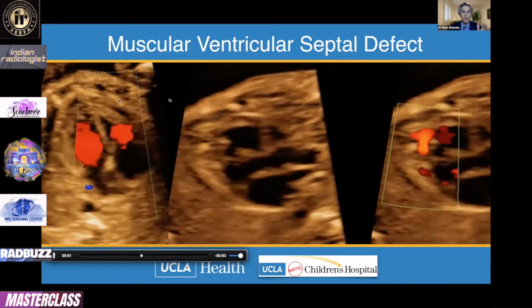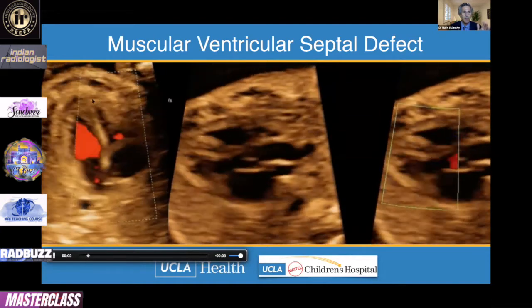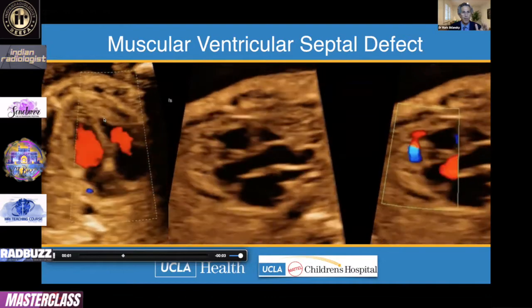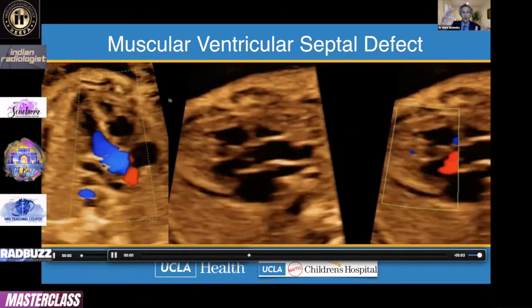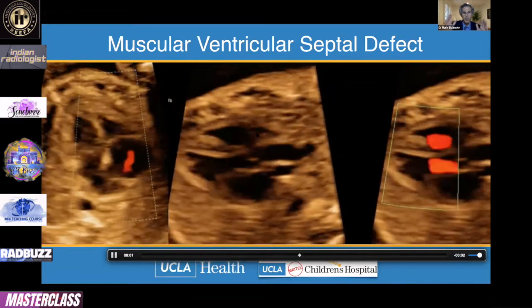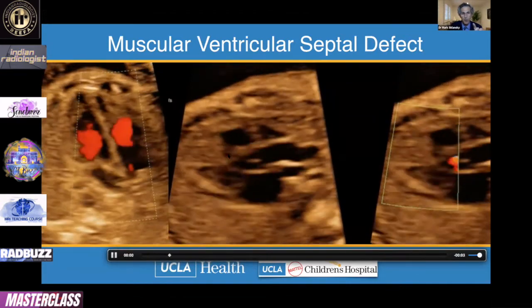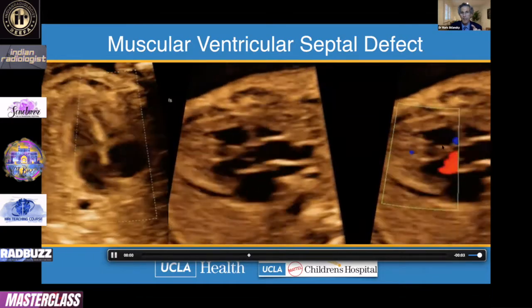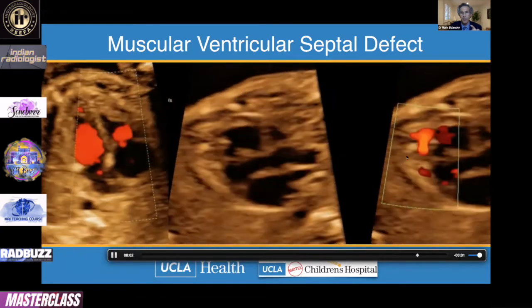This is all the same patient. Believe it or not, it is the same patient. You might get a glimpse of a low color there. Here we move the probe around, as I talked about before, to optimize the angle. Here's my favorite view. You could start to see maybe dropout here, but actually the VSD is down here, and you can see that only with color.